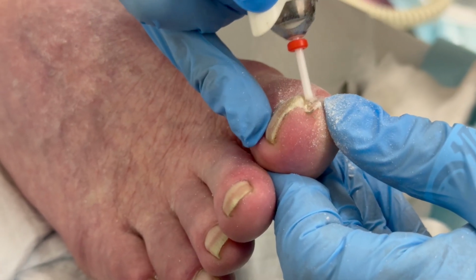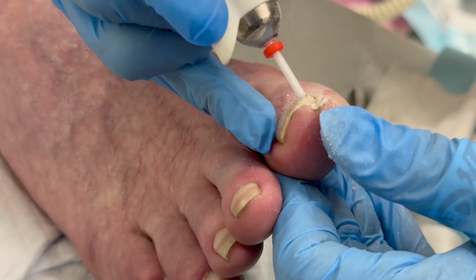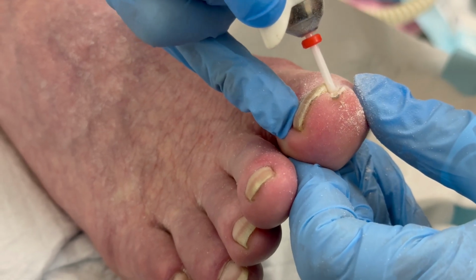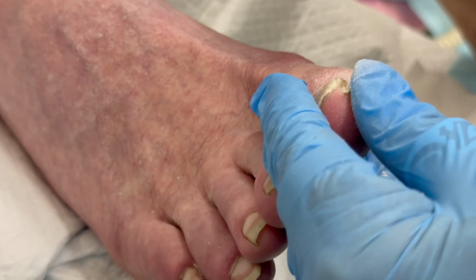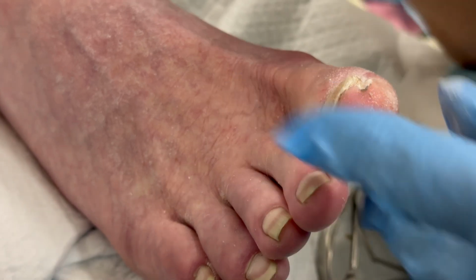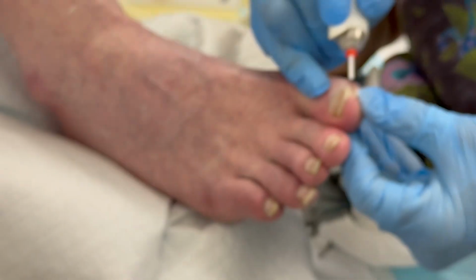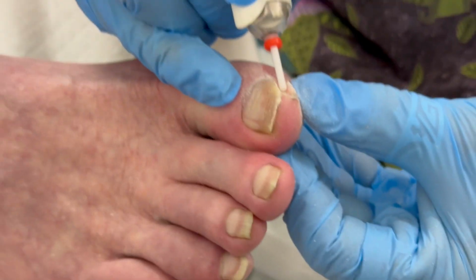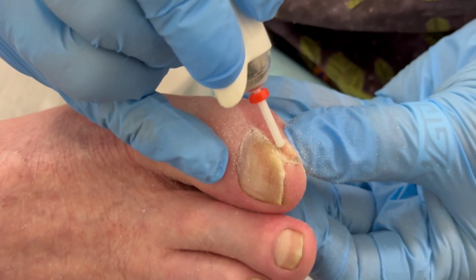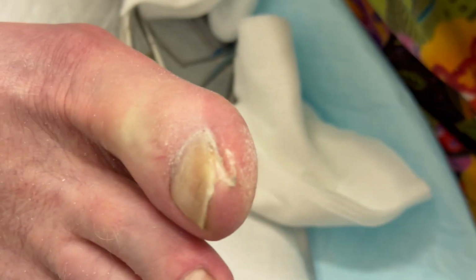Okay. Yeah. Okay, so now at this point, I'm going to squeeze a little bit. It hurts down? Well, I can tell that's... You can tell? Okay, so this spot right in there, see where it's white? That's where we're going to try to go.